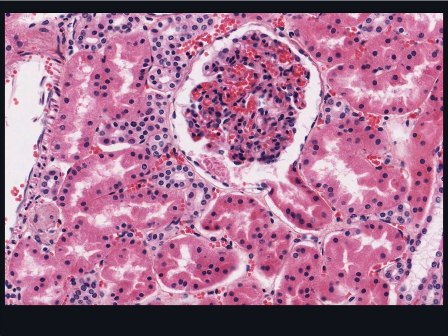Before I leave this image, look here, where the parietal layer of Bowman's capsule becomes contiguous with the proximal convoluted tubule. This area is referred to as the urinary pole. And just make sure you're happy distinguishing the proximal convoluted tubules from distal convoluted tubules.